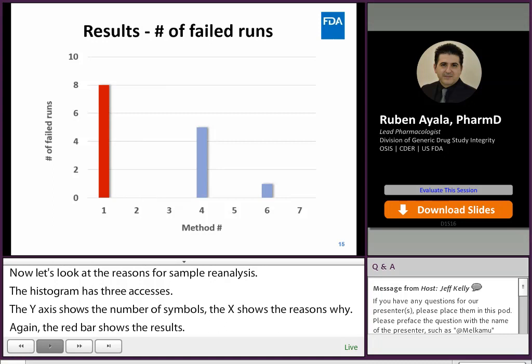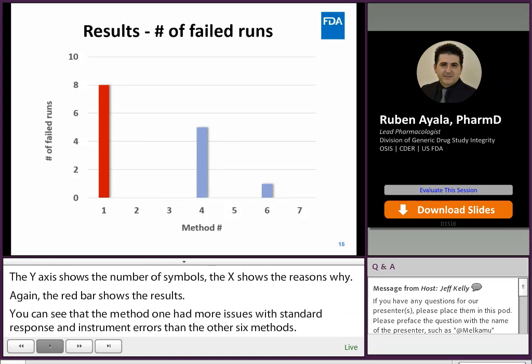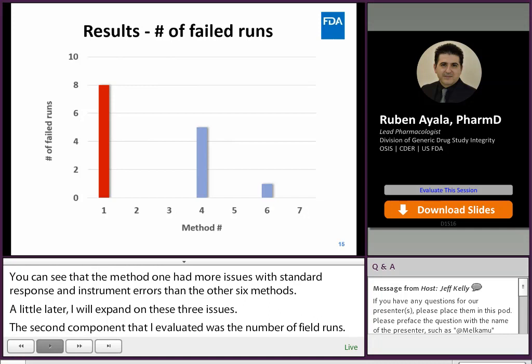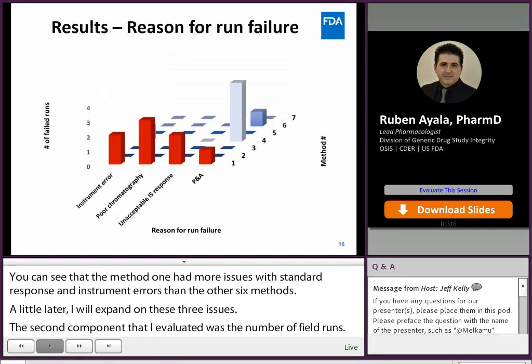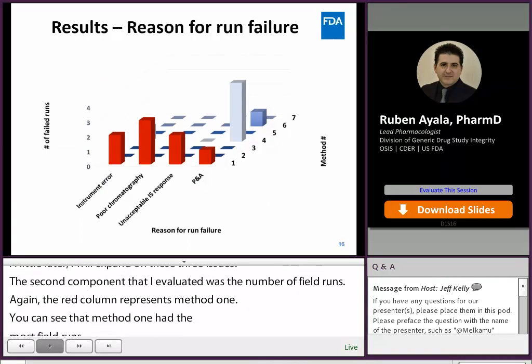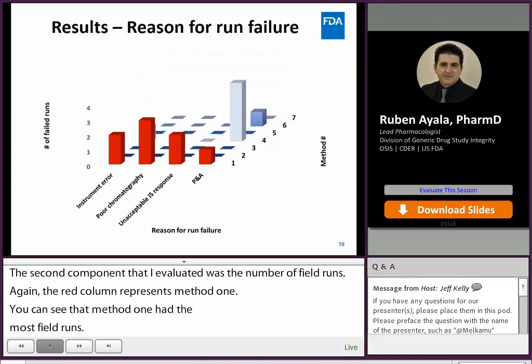The second component evaluated was the number of failed runs. Again, the red column represents method one. Method one had the most failed runs containing subject samples among all the methods. The reasons for failed runs in method one included instrument errors, poor chromatography, unacceptable internal standard response variability, as well as precision and accuracy issues.